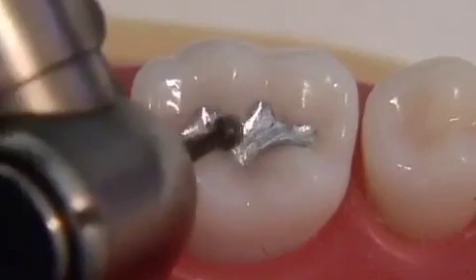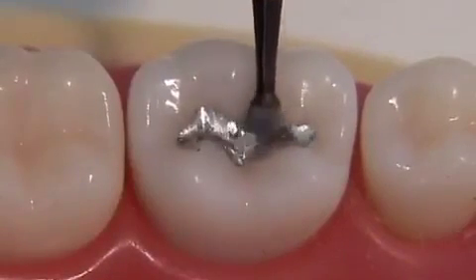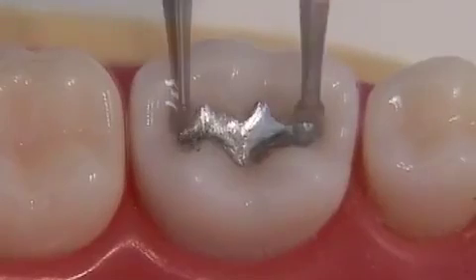Polishing the amalgam will help to create a smooth cavo surface margin, resist corrosion, reduce plaque retention, and potentially increase longevity of the restoration.